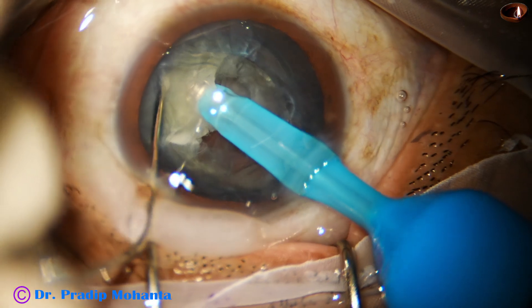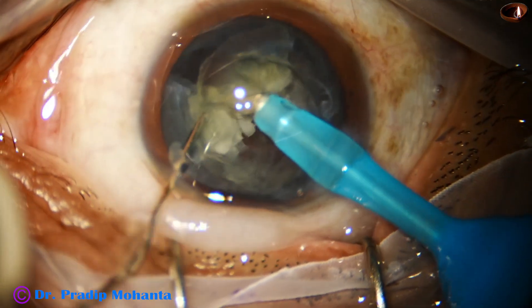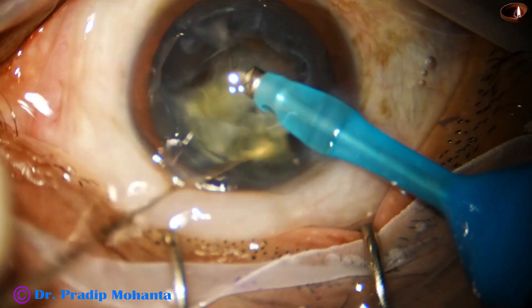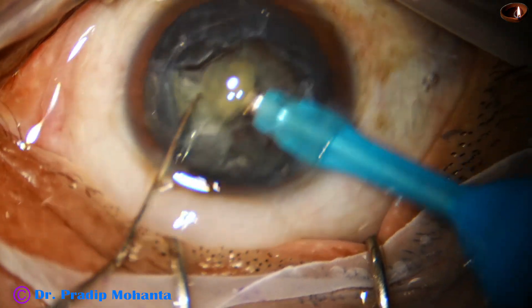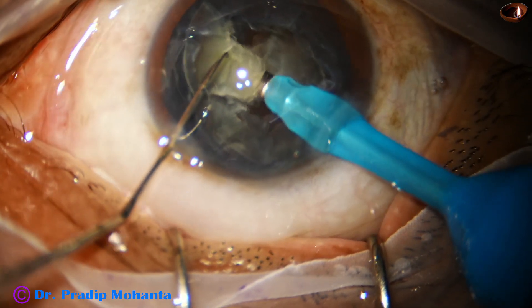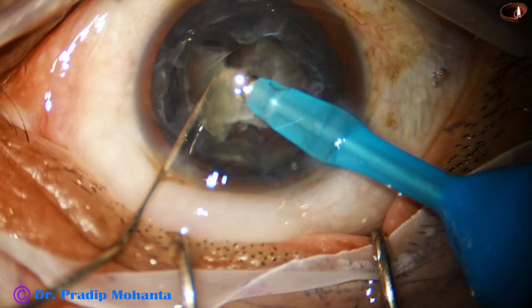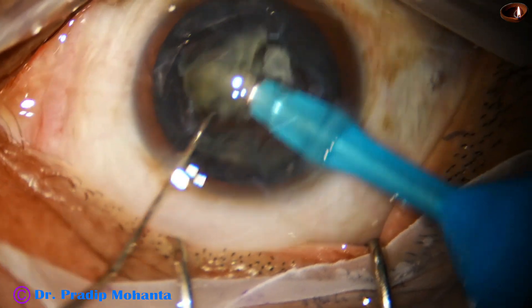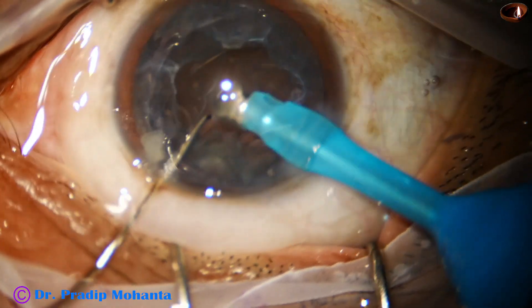Another very good crack, and now emulsification of the pieces is being carried out by her. All the time the handpiece is very stable, and the tip of the feco needle is in the center of the anterior chamber at the iris plane. This is a real-time video clip.